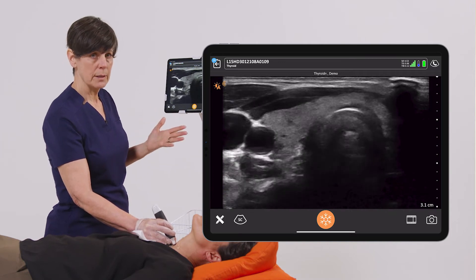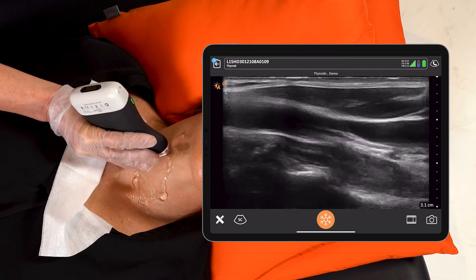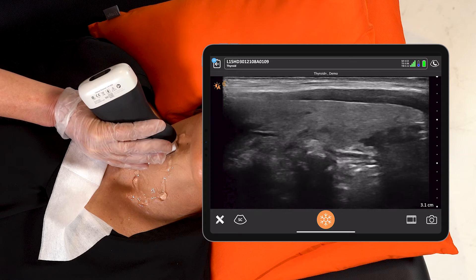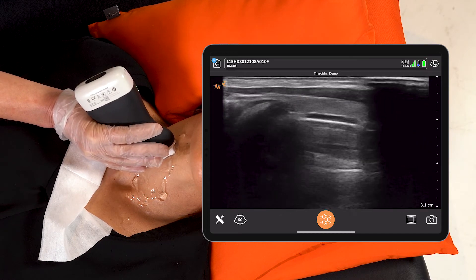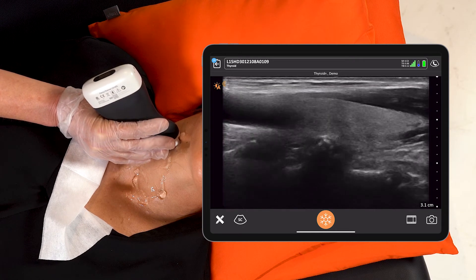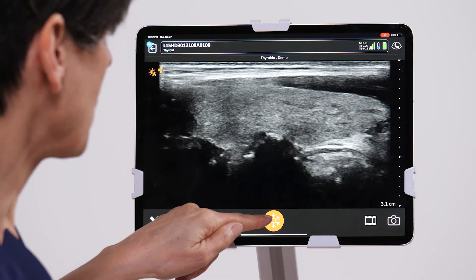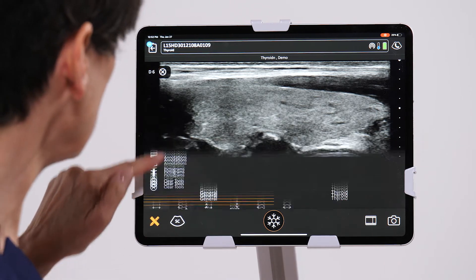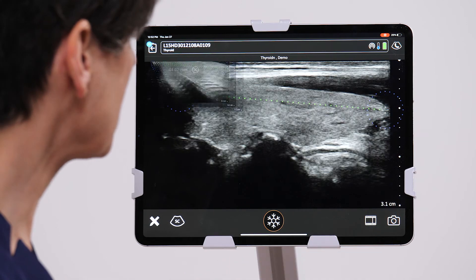Now from here I want to look at the thyroid in long axis, so I'm going to rotate the scanner 90 degrees. Here we can see a nice image of the entire right lobe of the thyroid. I'm going to scan from medial all the way to the trachea to lateral, looking for abnormalities. When I'm happy there's nothing there, I'm going to freeze the image and do a long axis measurement of the right lobe from the superior to inferior pole, then take an image.